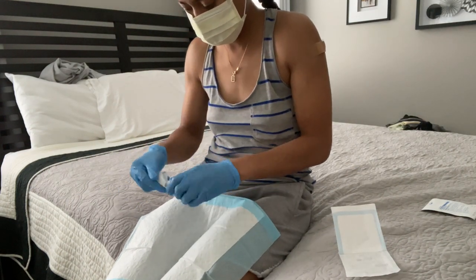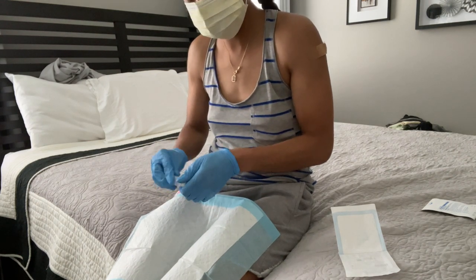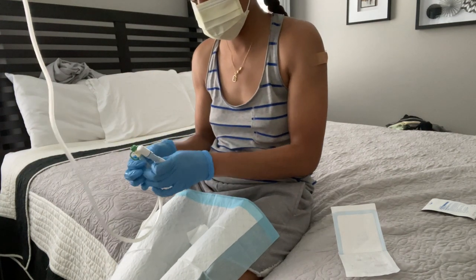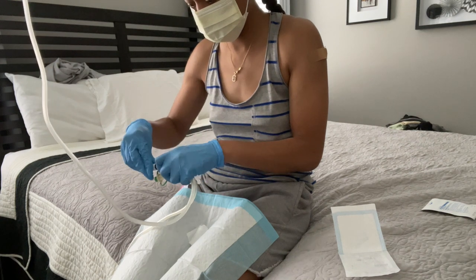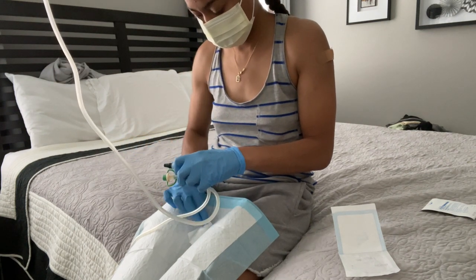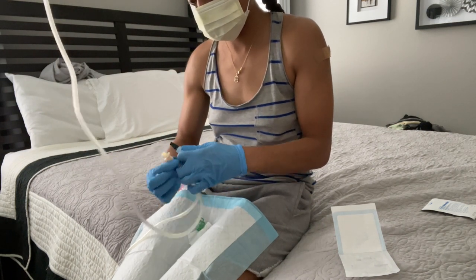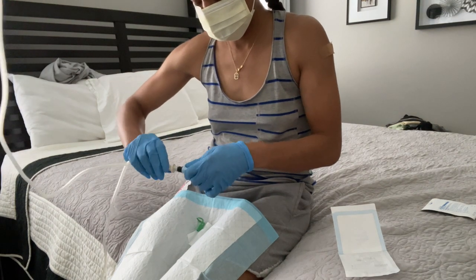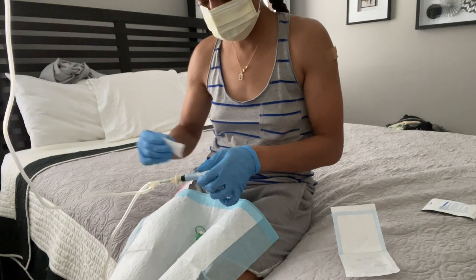Before I even open my dialysis port I like to sanitize the outside of it — that way when I do finally open it, no germs are able to get inside. I also like to grab the manual dialysis bag connection tube before I actually open the port so it is a quicker connection. Anything to help prevent infection. Make sure it's a tight, secure connection — just something very similar to how you connect to your AMIA machine.